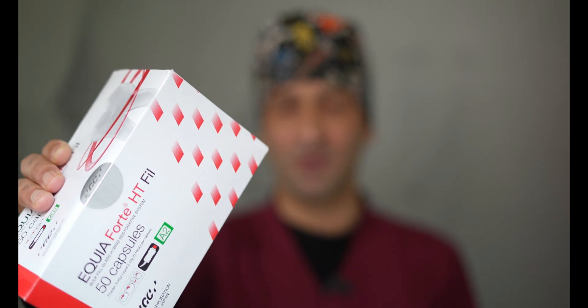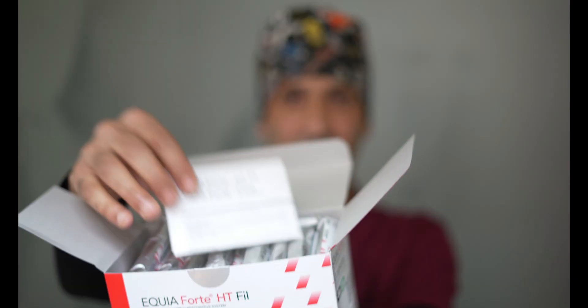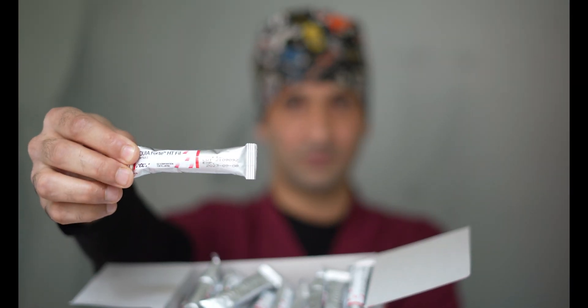The EQUIA Forte HT comes in a box of 50 capsules, and each capsule is placed in an airtight foil cover, along with an instruction manual. The EQUIA Forte HT is not a glass ionomer — it is actually a glass hybrid material. The letters HT in the name stand for hybrid technology.